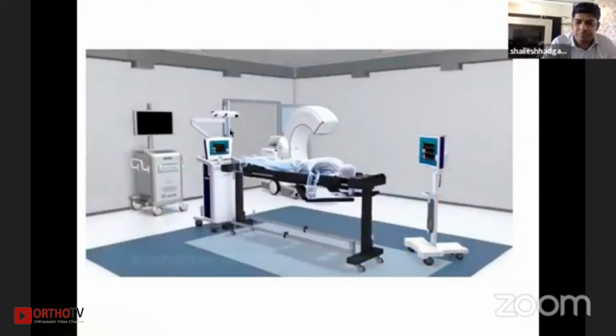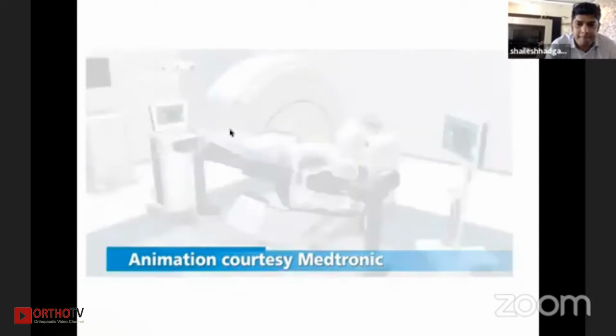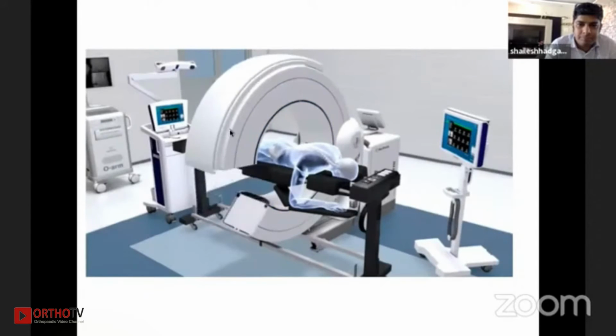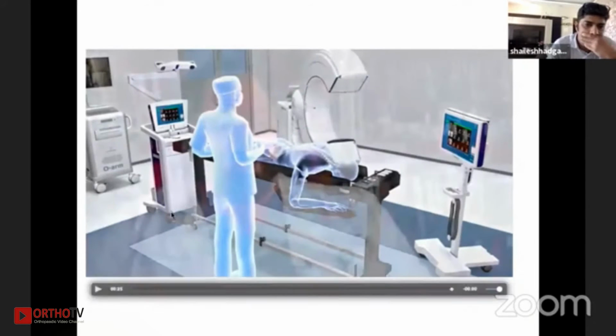The OARM surgical 3D imaging system allows neurosurgeons and orthopedic spine surgeons to view highly detailed, real-time images of the spine during surgery. The 3D images are displayed on a large monitor, allowing the surgeon to see exactly where to place surgical instruments and implants while carefully maneuvering around spinal nerves and nearby organs.